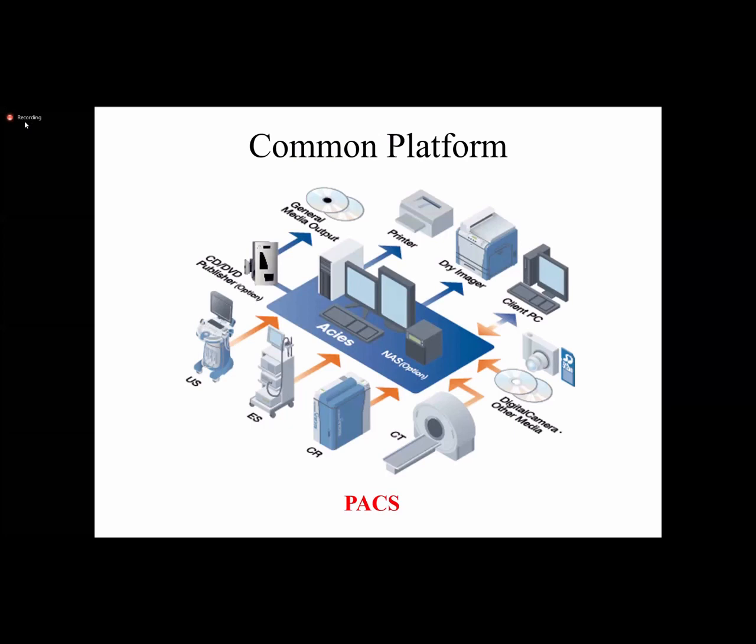So this is the biggest advantage we have if we have the PACS system. And PACS is also a user-friendly system, we can say. PACS gives you all kinds of features and functions which we have in the equipment, a lot more features which we don't have in the MRI system or CT system. So PACS also gives us that kind of features.